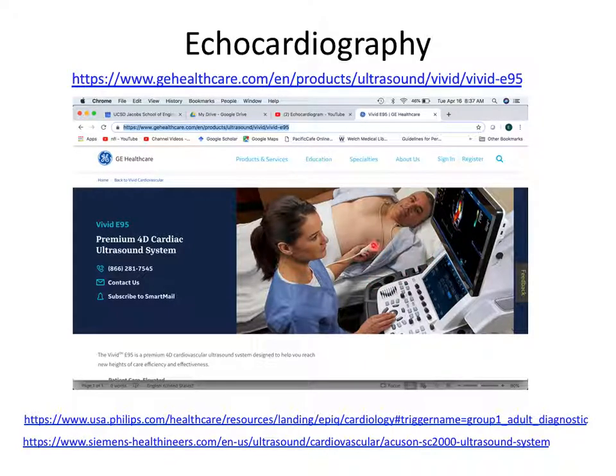So you have to point the sound between the ribs or underneath the rib cage. You can put the transducer down here as well. So I've put a couple of websites up here. I wanted to be agnostic in terms of company, but GE Health, Philips, Siemens, and there's Toshiba, a lot of other ultrasound companies. And to look at state-of-the-art pictures of ultrasound, these are the best places to go. These are sites where the companies show their latest and greatest stuff.